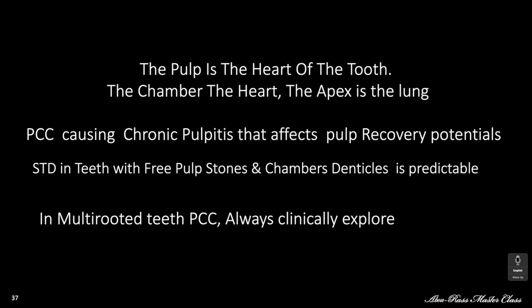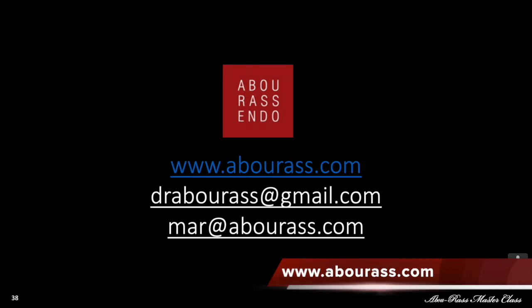I want you to know that standard endodontic treatment is possible and predictable with cases with pulp stones and chamber denticles. Remove them and you can do a root canal. And that, at the end, in multi-rooted teeth, do not believe calcification on x-rays. Always explore, clinically explore. Thank you for listening.